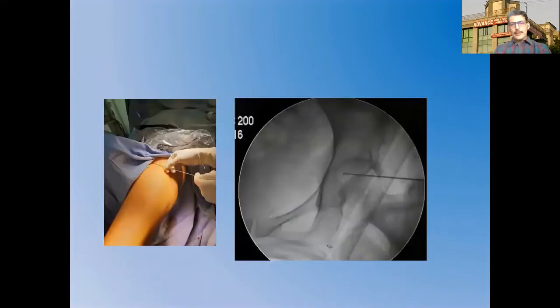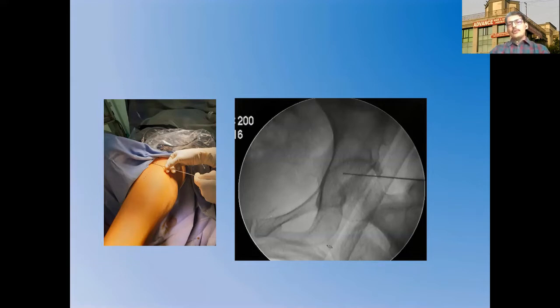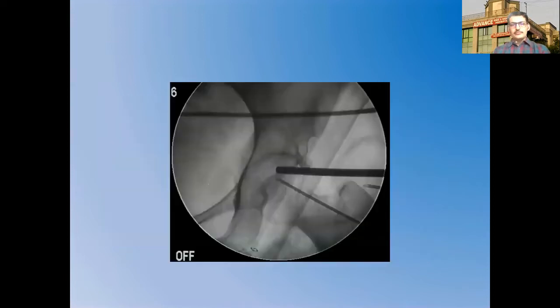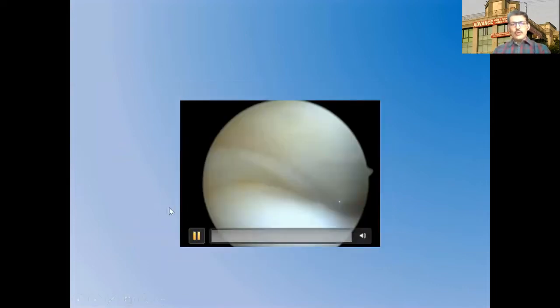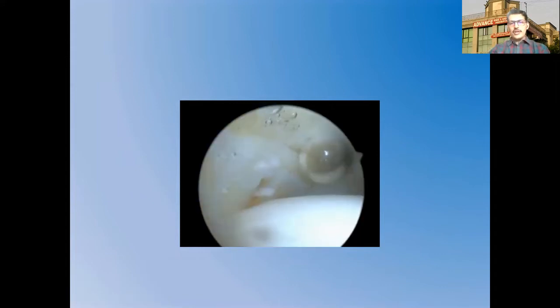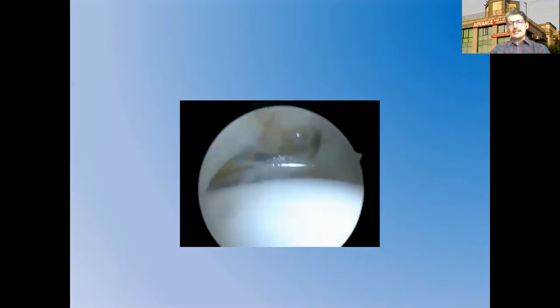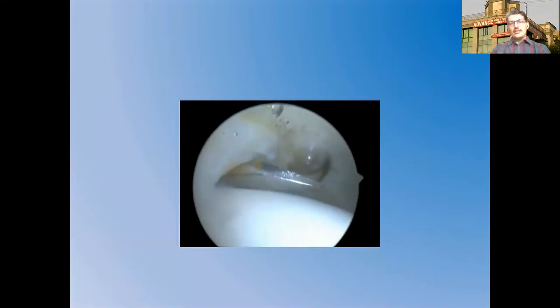Hip arthroscopy was performed in the supine position. The anterolateral portal was made as the first portal. Once the needle was inserted, a finding called an air arthrogram was seen, confirming the needle is inside the joint. The needle position can also be adjusted to ensure it is not penetrating through the labrum. When the air arthrogram is made, injecting saline allows fine adjustment of needle position.